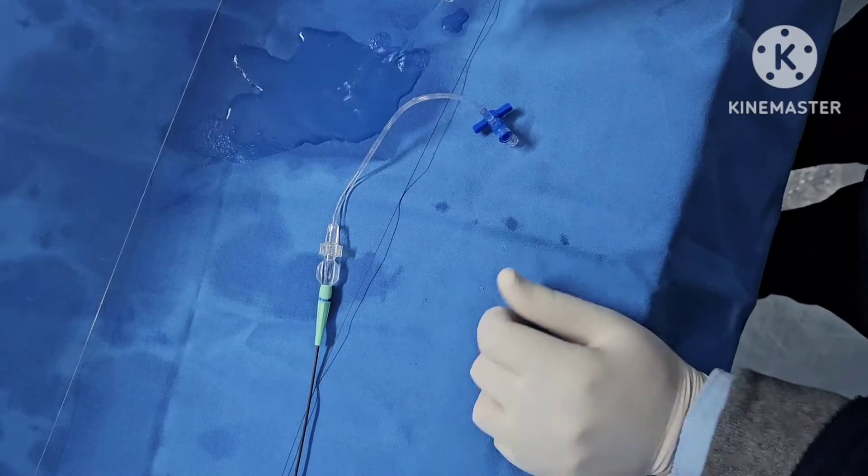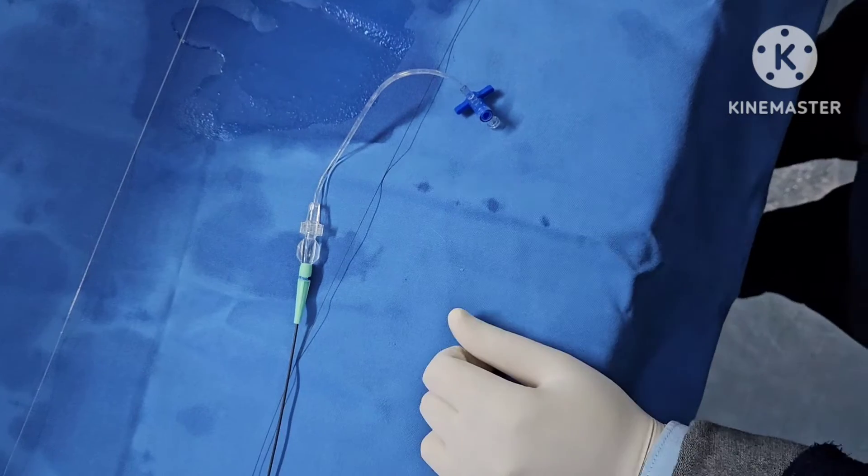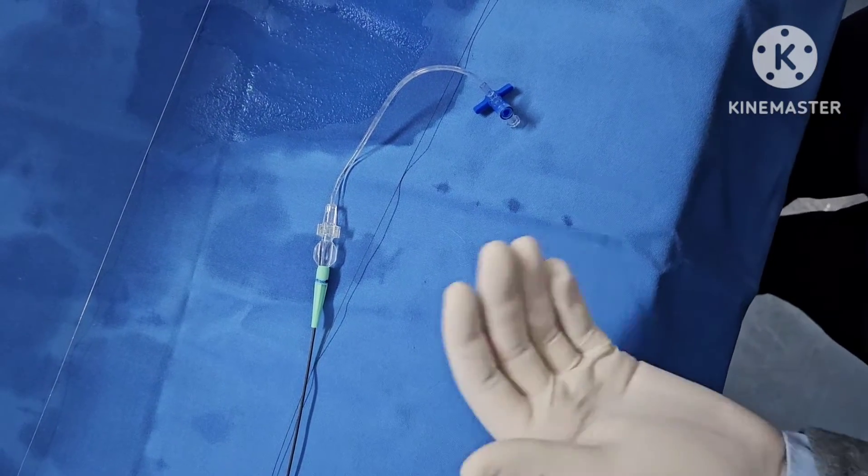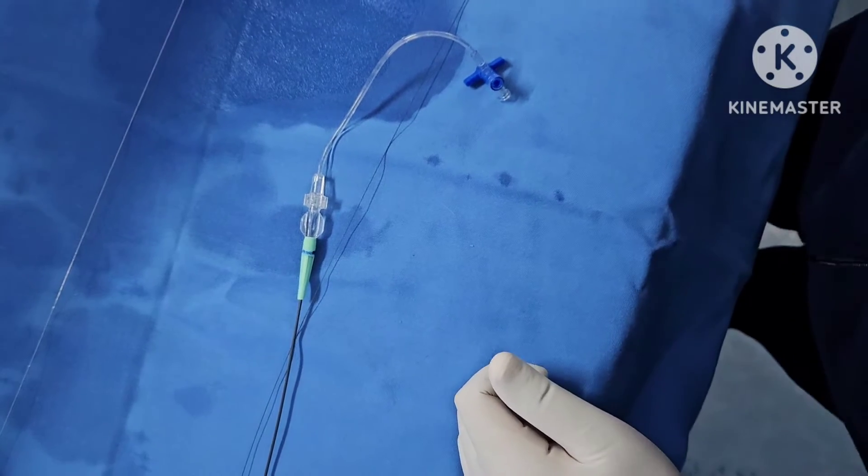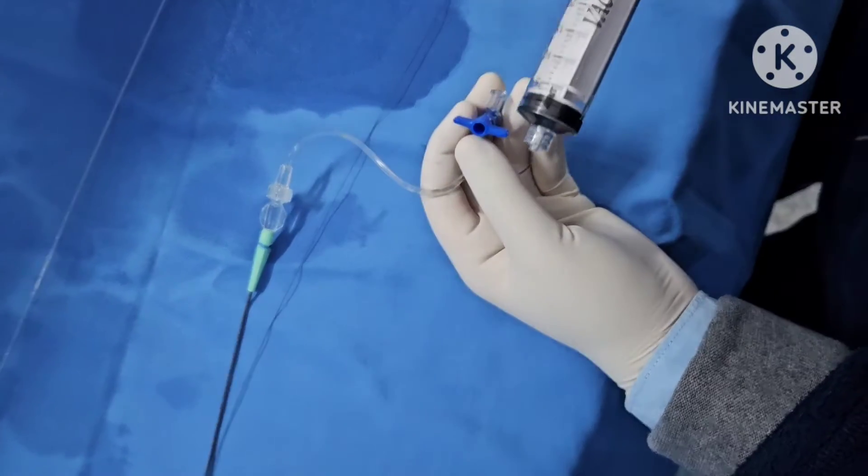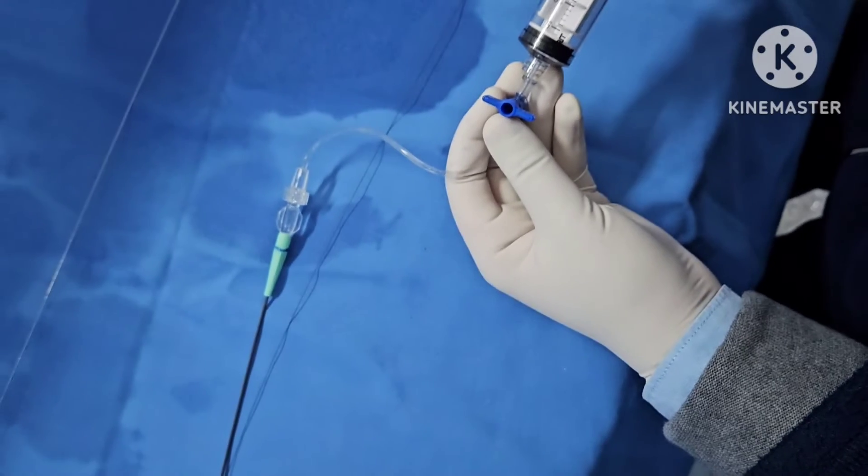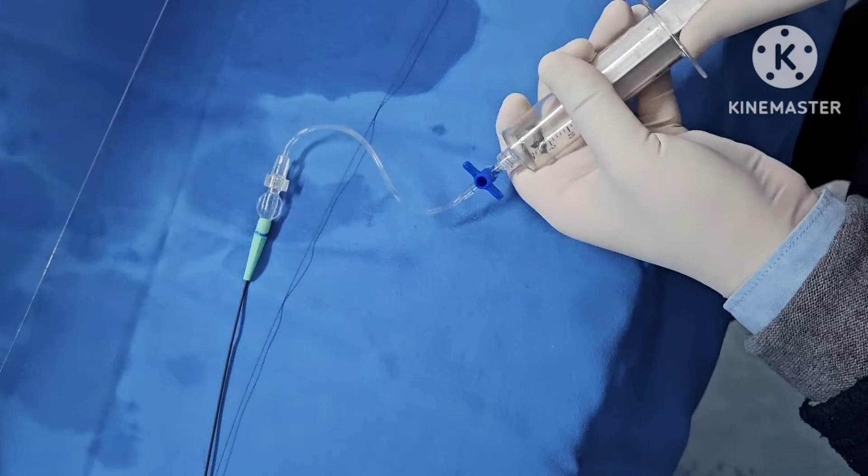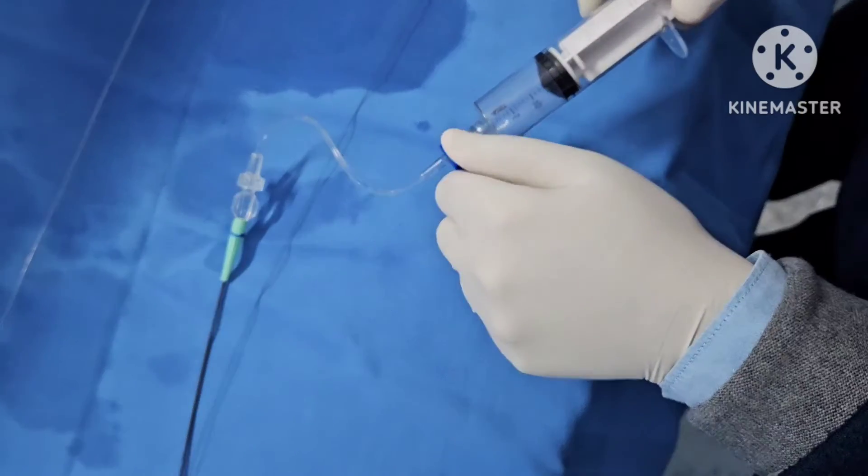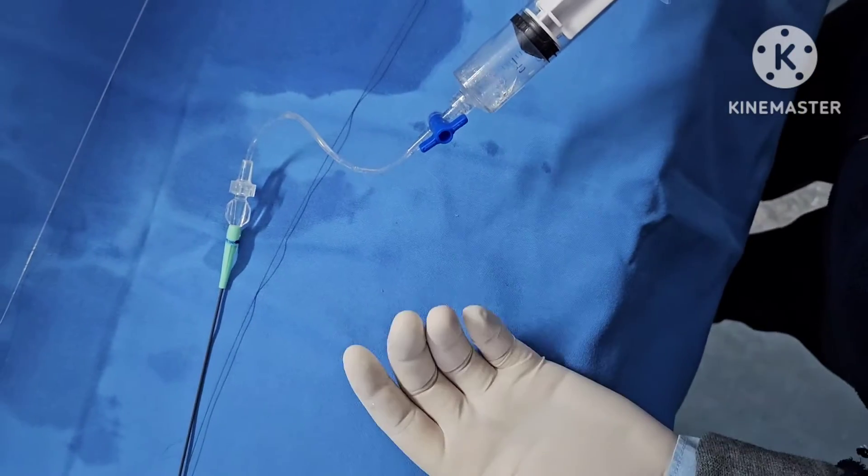And this is very helpful in high thrombus burden. If you want to reintroduce the catheter, you can just again put a negative pressure on this syringe like so, and just put a negative pressure and you can re-aspirate.